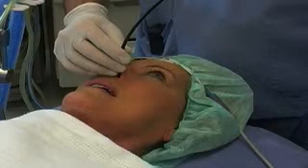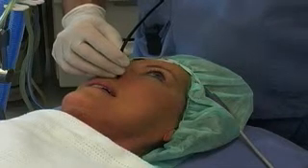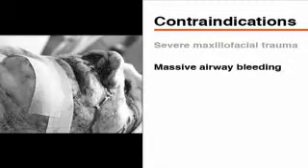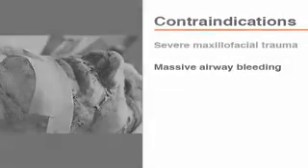Nasal fiber optic intubation should be avoided in patients with severe maxillofacial trauma, since the fibroscope or the tube may inadvertently enter the brain. Massive airway bleeding is a relative contraindication to fiber optic intubation and should only be used by experienced anesthesiologists.